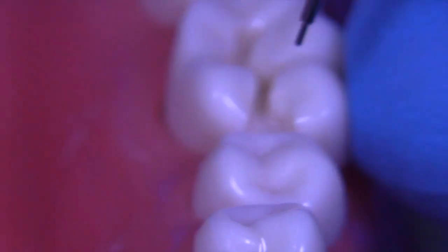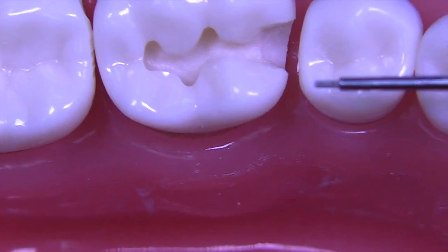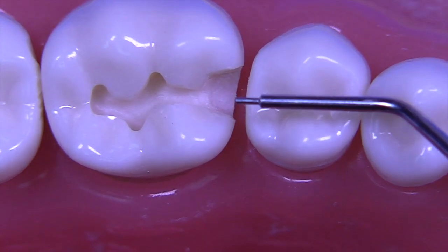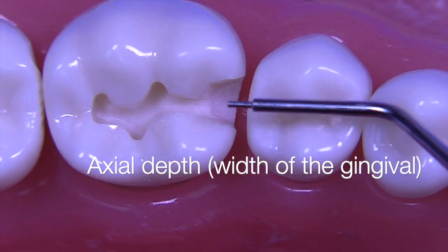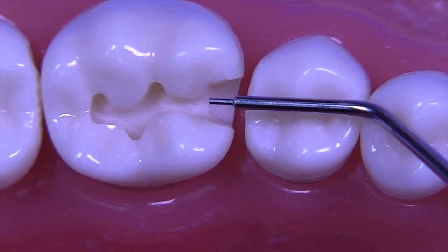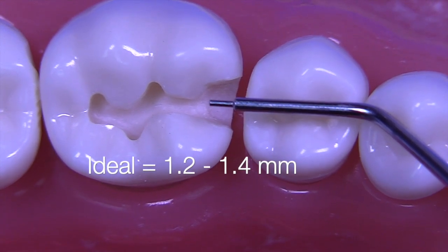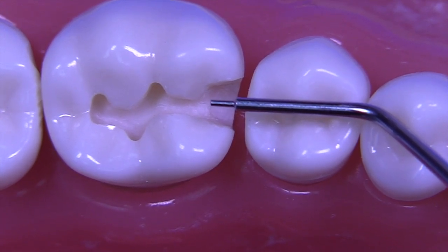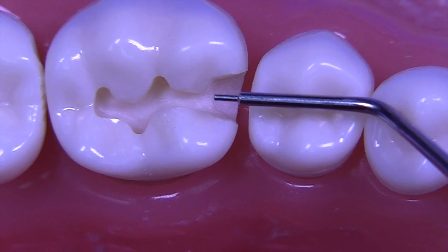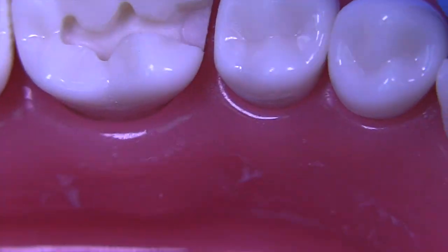When it comes to the depth of the axial, we like to look at the axial wall from this occlusal view, and axial depth is the distance we take from the outer cavosurface into the axial wall. And ideally, we'd like to be around 1.2 to 1.4. Now this is an RGS 1, and that measures 1.5 millimeters in length. So that means that you're a bit on the maximal side, not quite conservative enough.